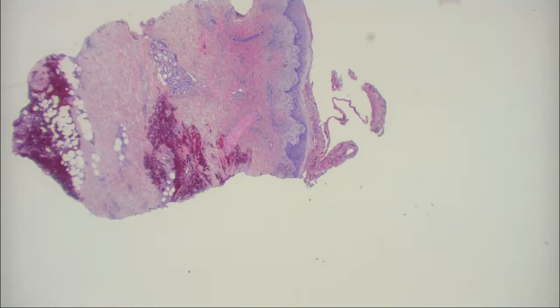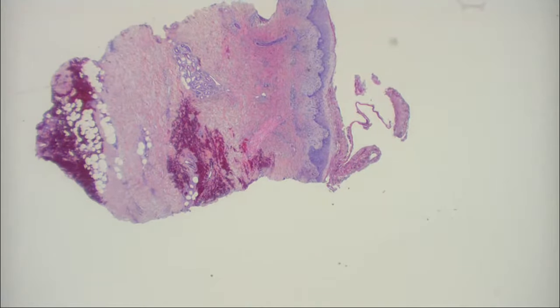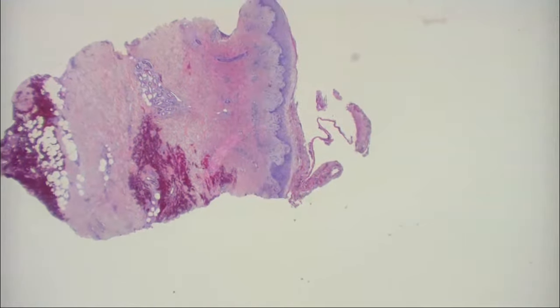So here, punch biopsy, it's like a non-acral skin. So going down and looking, is it inflammatory or neoplastic? Inflammatory. Good. What's the pattern? Spongiotic. Well, let's look at that at a little bit higher magnification. There's really no spongiotic microvesicles here, right? We have color changes.